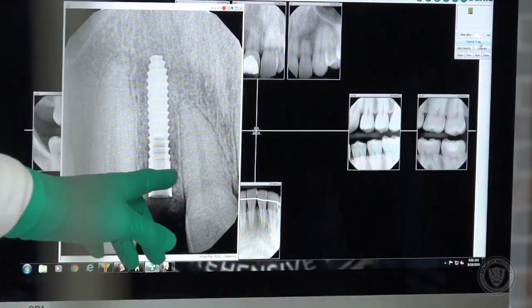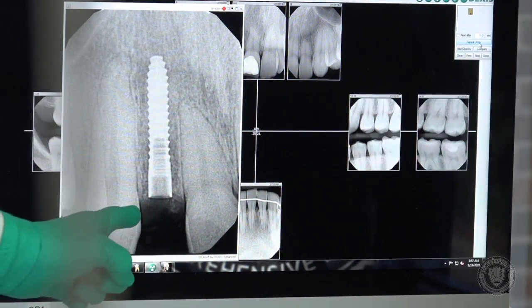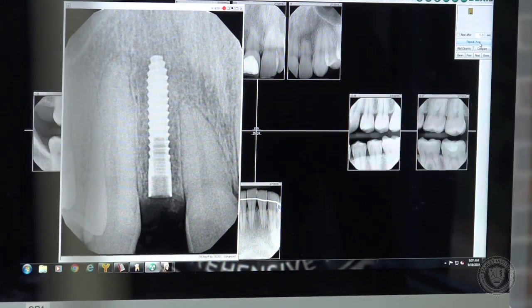Look at this distance on either side. Tarnow's rule — one and a half millimeters between the tooth and the implant — is just beautifully held here using a guide. It's just so low stress. It's such a beautiful way to do it. We also know that we don't have any buccal perforations or anything like that as well.